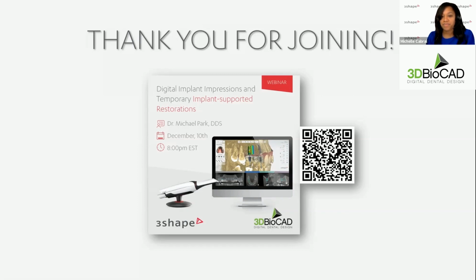Maybe there's a message yet. Is that a question? I think it's a question about 3Shape Communicate, which is how the doctor's Trios sends to the laboratory software. As you know, we have 3Shape Communicate, which connects the Trios software to the laboratory dental system software.